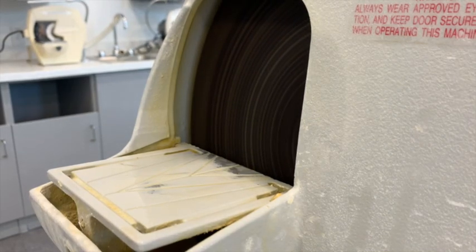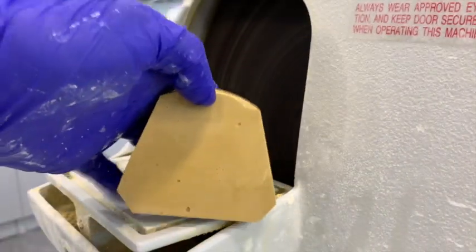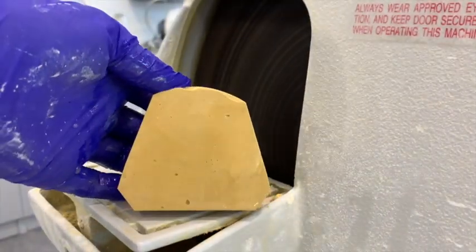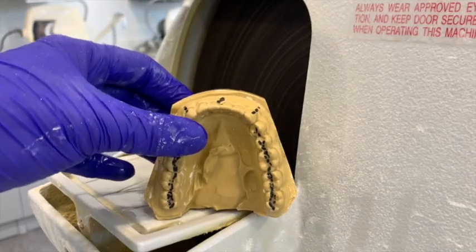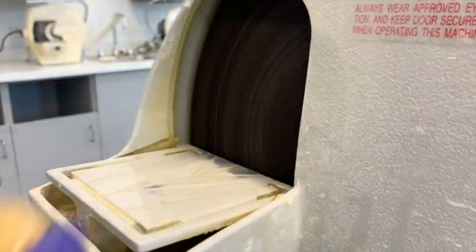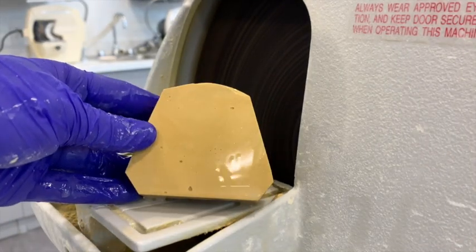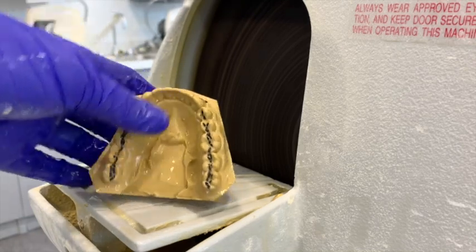Make sure you rinse between each cut. Now we can do a couple of final touches, and there you have the shape for the mandibular model.